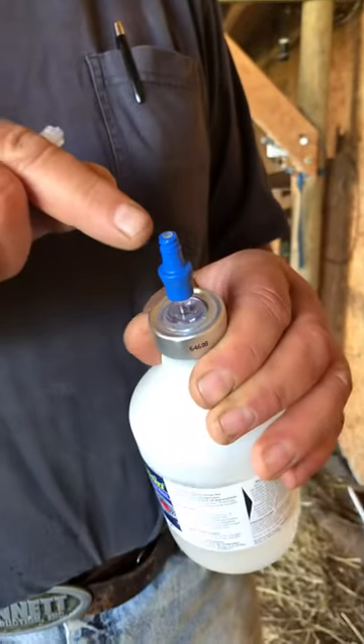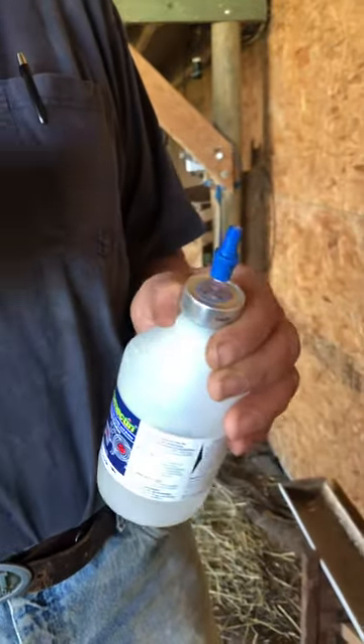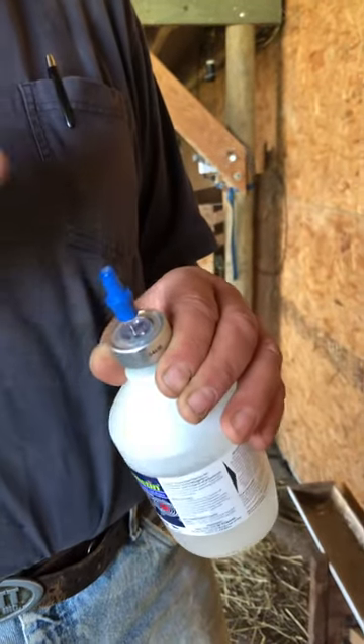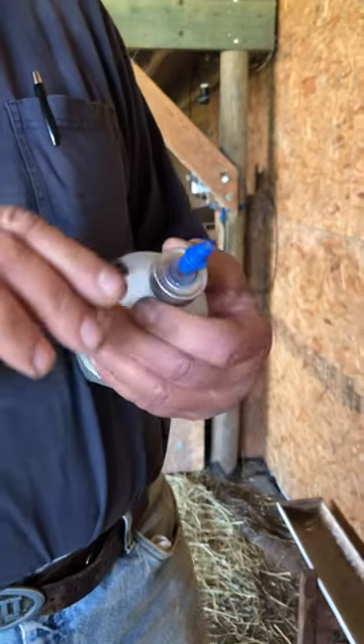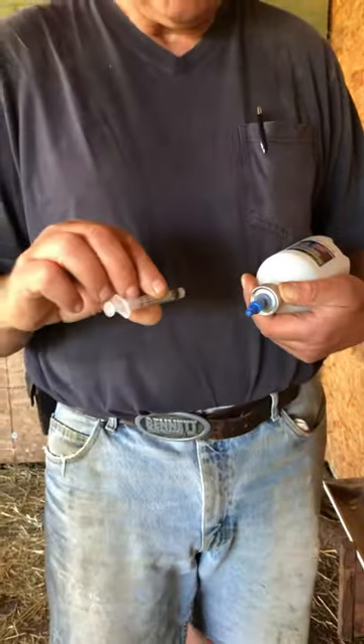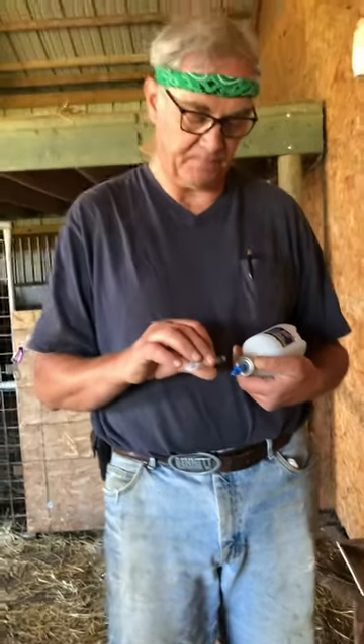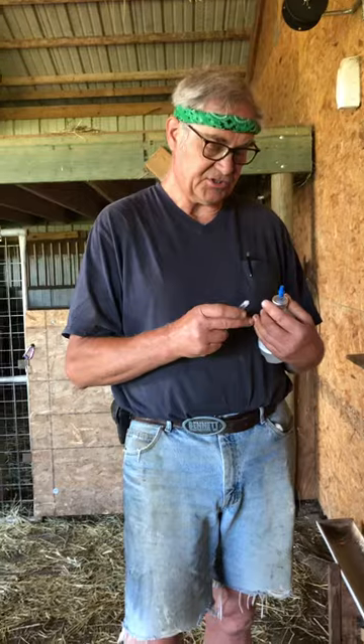I use a multi-dose vial spike. I get them from my vet for less than two dollars. They're sterile when you get them — you put it in the bottle and it stays in there. That way you're not doing repeated punctures of the rubber stopper with needles. You just have one.